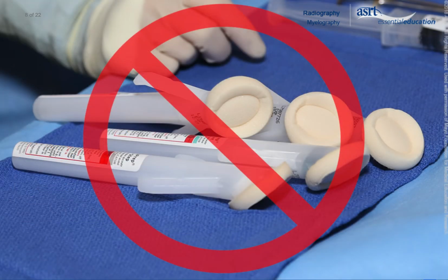Chlorhexidine gluconate, also known as ChloraPrep, is contraindicated for procedures which may have contact with the meninges. Refer to facility policy for use of chlorhexidine.